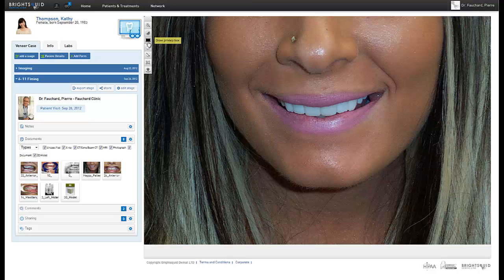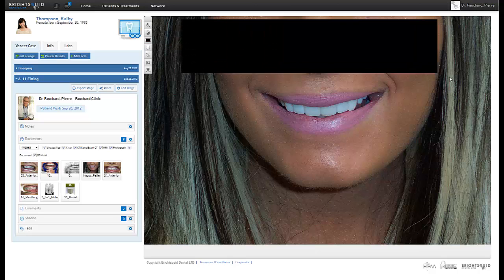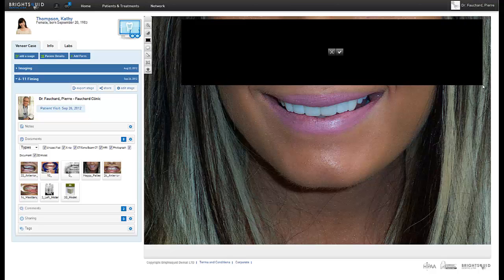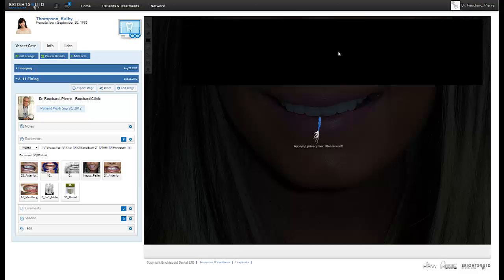This is the privacy box. It allows you to obscure or black out a section of the displayed image. Single-click on the box, then click and drag on the image to draw your box. When you are done drawing, release the mouse button. If you are not satisfied with the created box, click on the X button to remove it and try again. If you are satisfied with the box, click the check mark to finalize its position. Note that once the box is finalized, it cannot be removed.